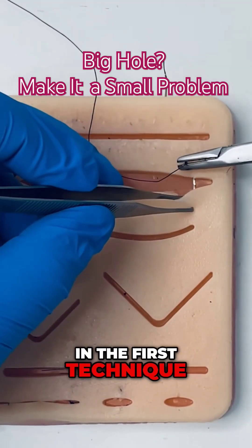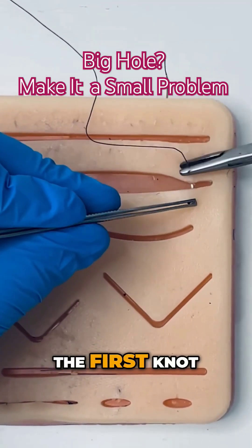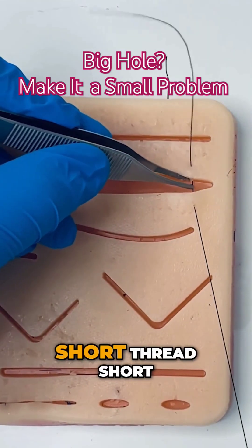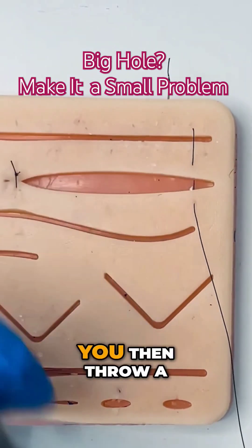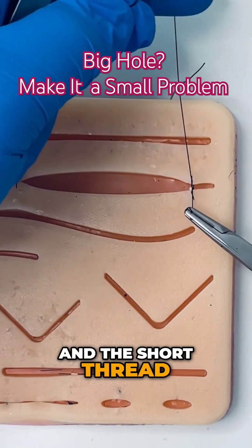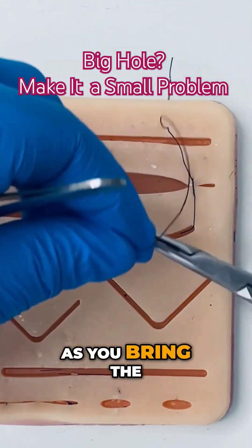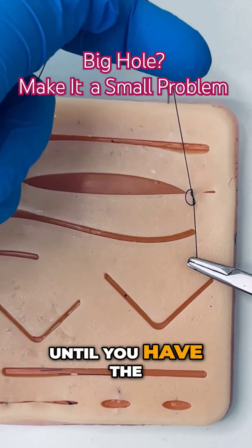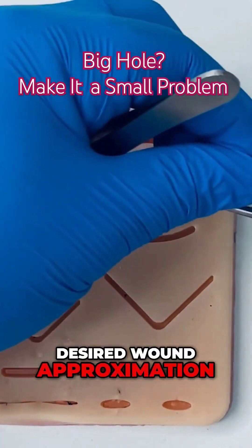In the first technique, after you have tied the first knot — the surgeon's knot — ensure to keep the short thread short. You then throw a reef knot, but you do not alternate the position of the long and the short thread. Instead, as you bring the short thread through the loop, you apply tension only to the short suture until you have the desired wound approximation.